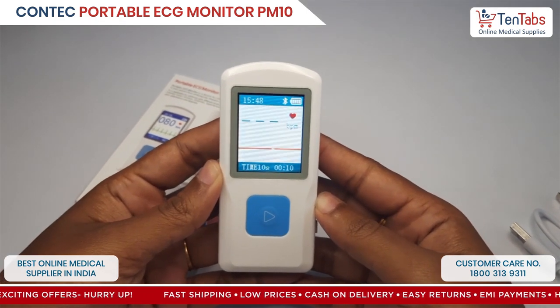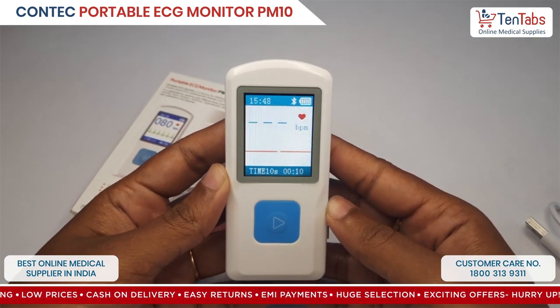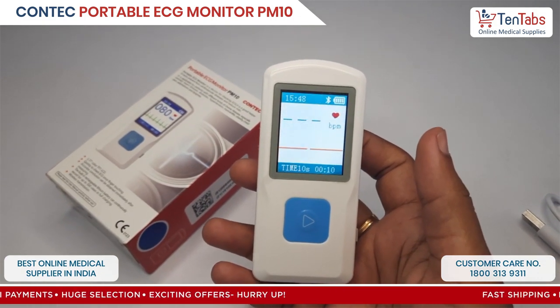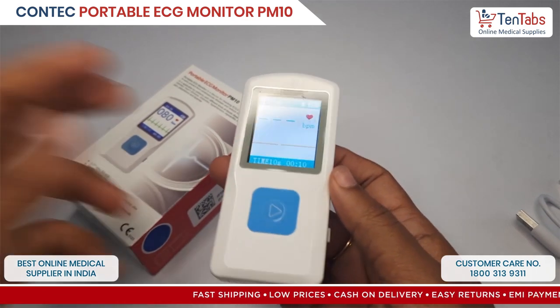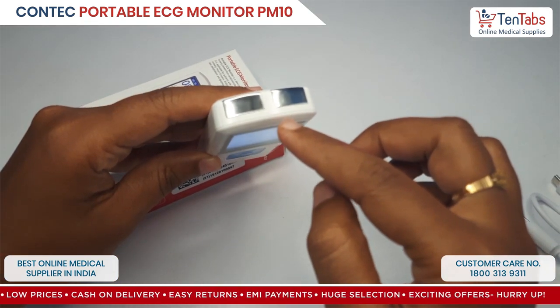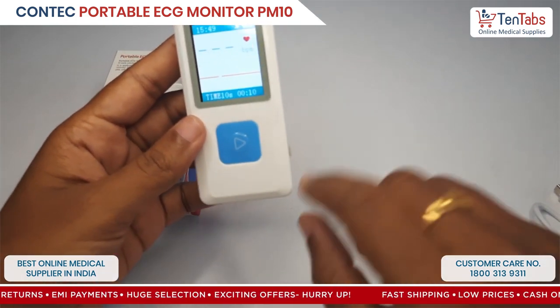This is the main interface, the main screen of the device. Now to collect the ECG signal or the heart rate, there are various different methods. You basically have to place these two metal electrodes in contact with the skin surface.